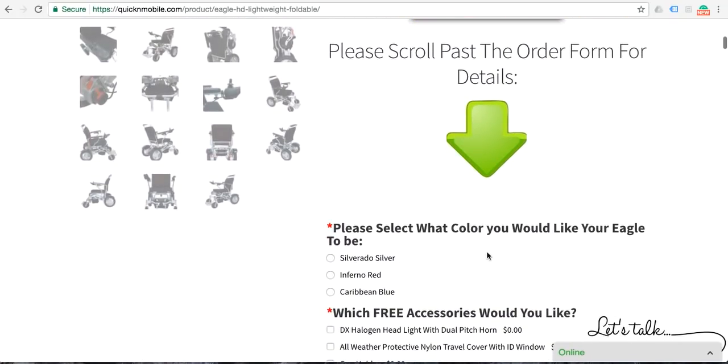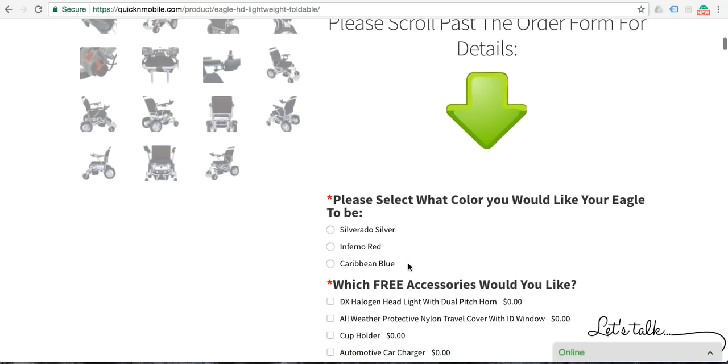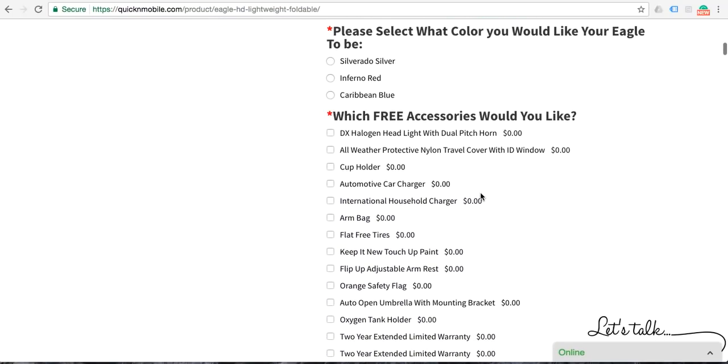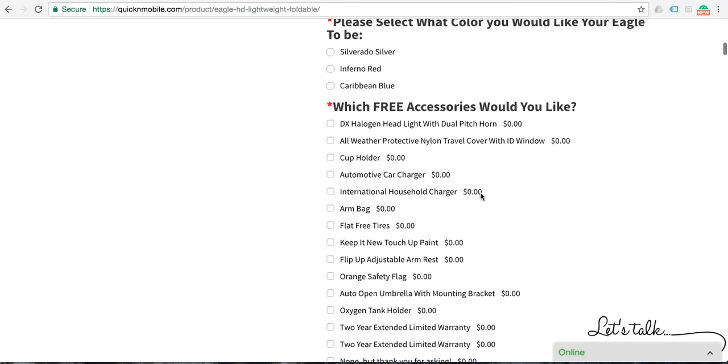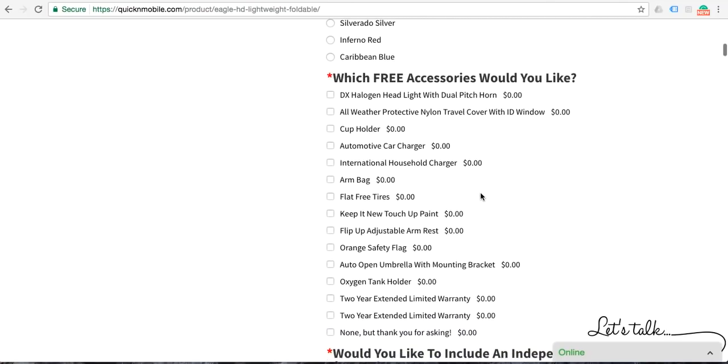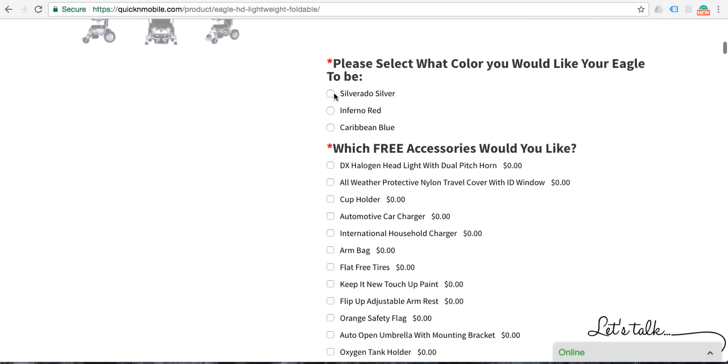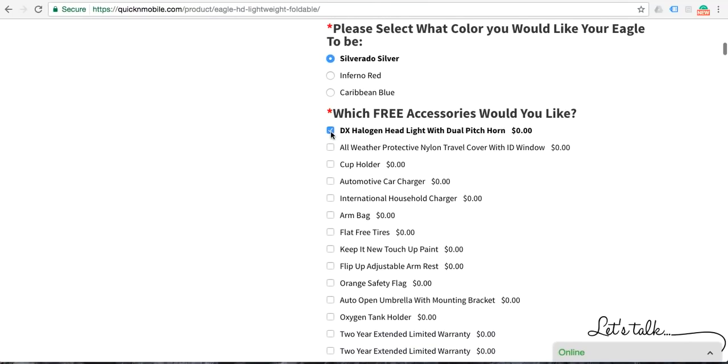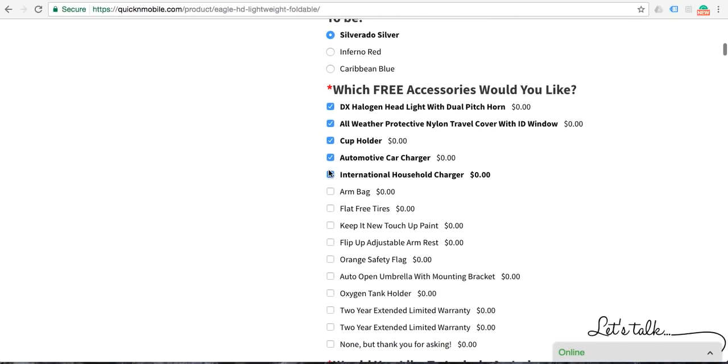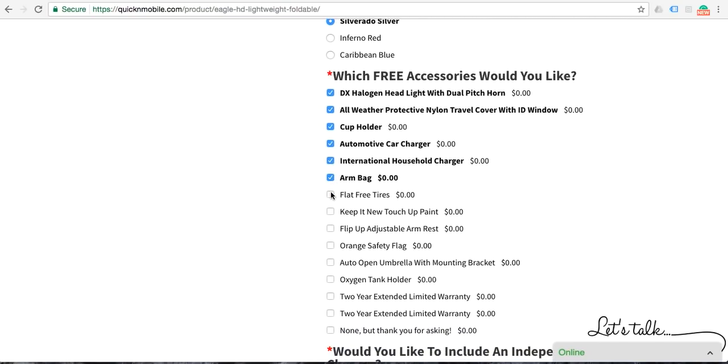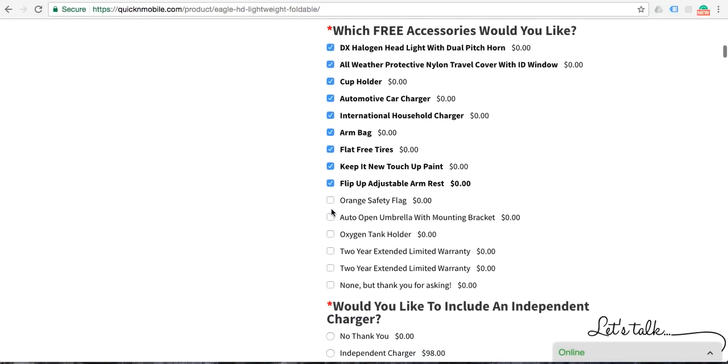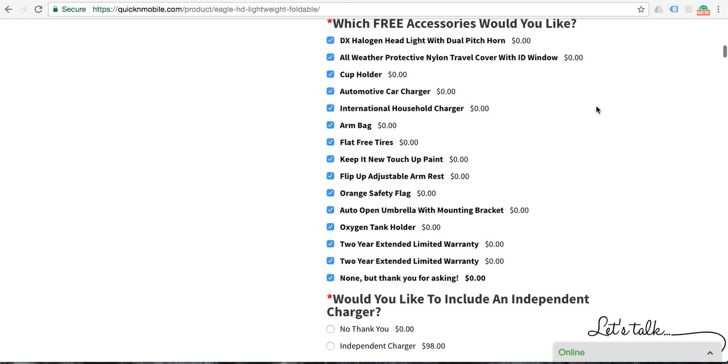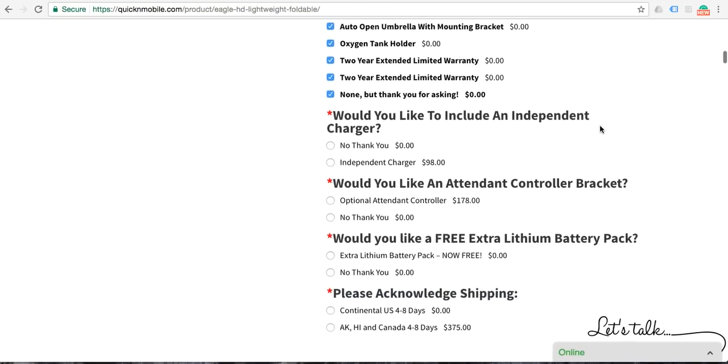The Eagle is available in three colors: silver, red, and Caribbean blue. Just like the Airhawk power folding wheelchair, we offer all of the accessories that you could expect. And you can see when you would add the accessories, each and every accessory does not include any additional charges. We will go over that toward the end of the video again.